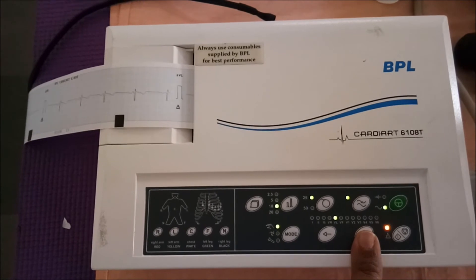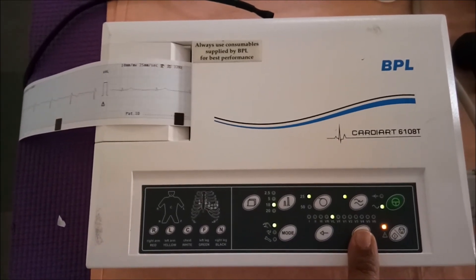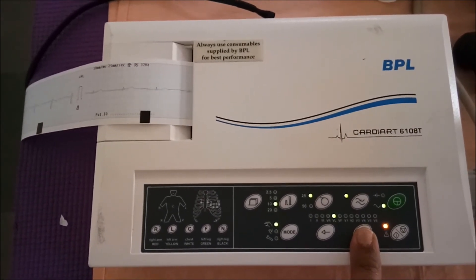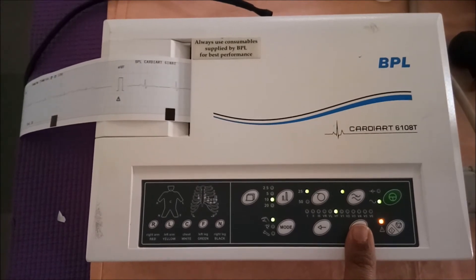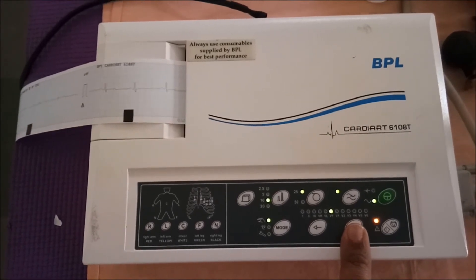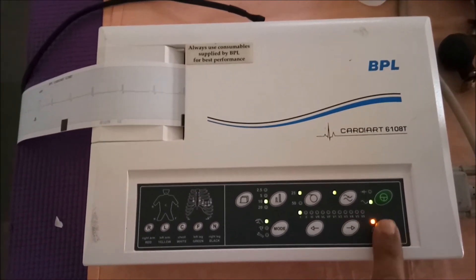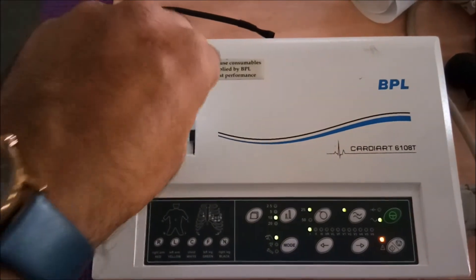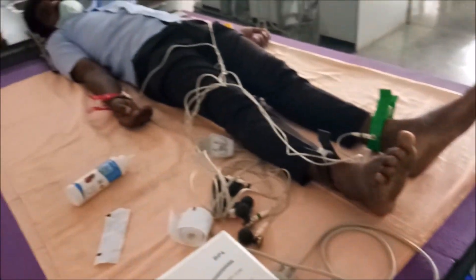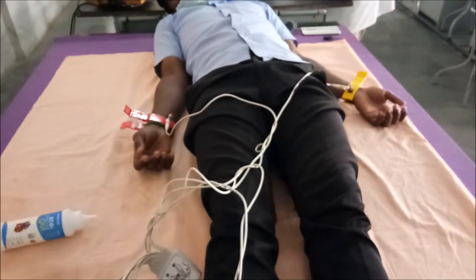If required, we can also choose chest leads separately — V1 to V6. Once done, stop the print, turn off the machine, and remove the electrodes applied on the subject. Clean the gel, and don't forget to thank your subject.